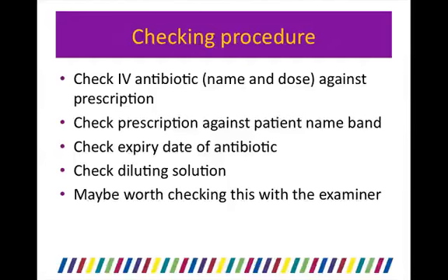Check the IV antibiotic, the name and the dose, against the prescription. Check the prescription against the patient's name band. Check the expiry date on the antibiotic. Check the dilution solution for its expiry date, and it may be worth checking all this with the examiner as well.